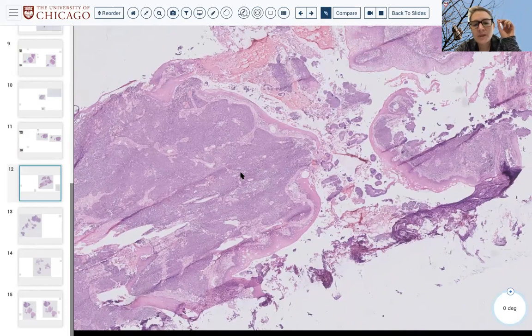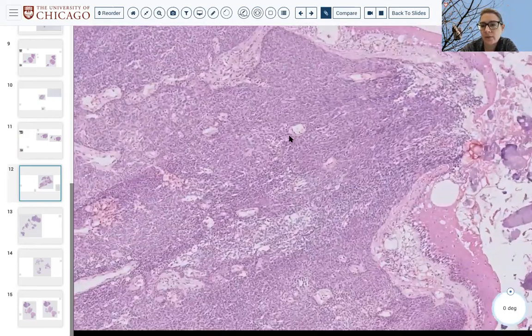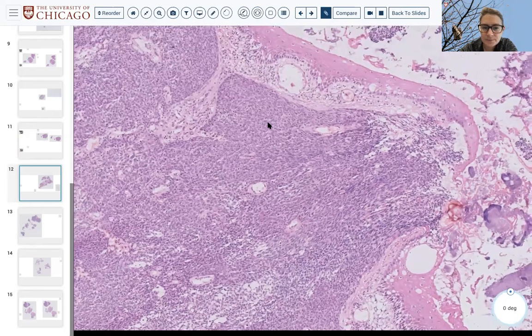We are no longer in a margin category. This was just a frozen of lesion, right? So they're looking for lesion. And so if you can tell them, yes, you're good, right? So yes, this is carcinoma. They're done. They found it.